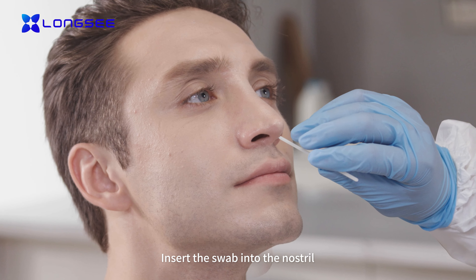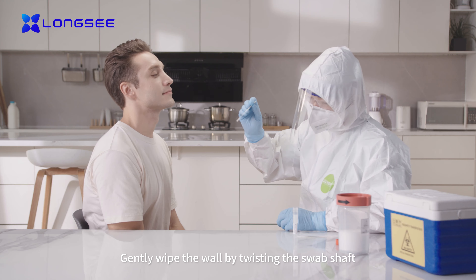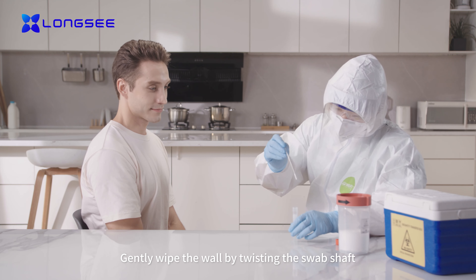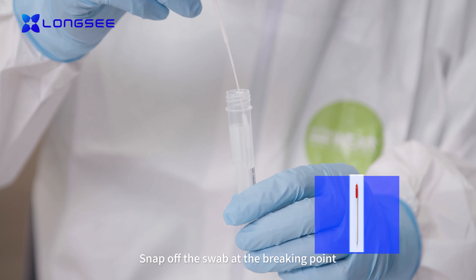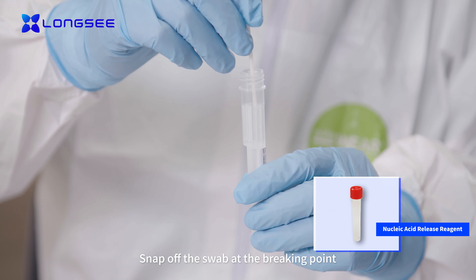Insert the swab into the nostril. Gently wipe the wall by twisting the swab shaft. Snap off the swab at the breaking point.